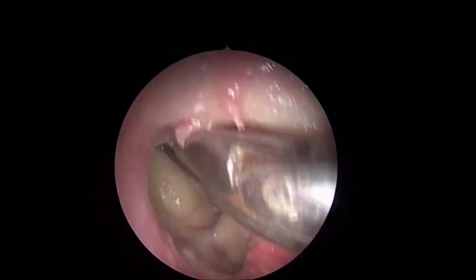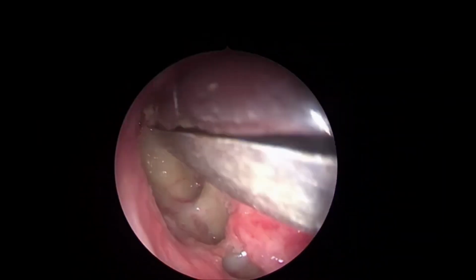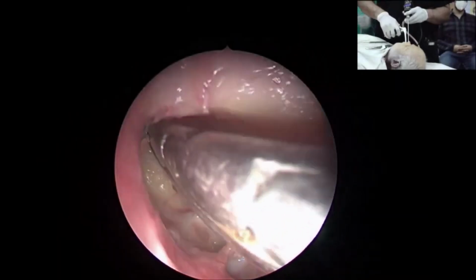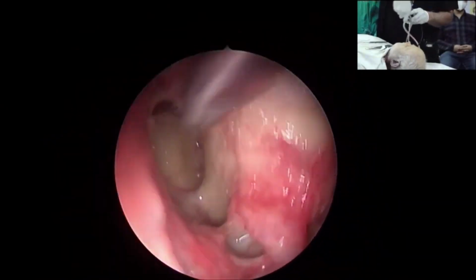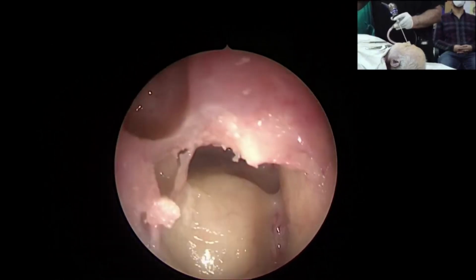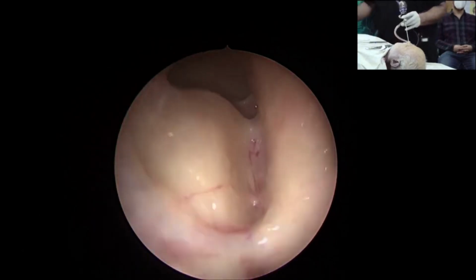See this? If you really want to punch a little bit of the beak to enlarge the entry further here, not much, a little bit of the beak. See this? I can take away this mucosa. This is a punch. We call it an articulated punch. See this? And see, our entry has improved. Can you see this? Yes, sir. This articulated punch can sometimes help you in improving access to your frontal sinus.